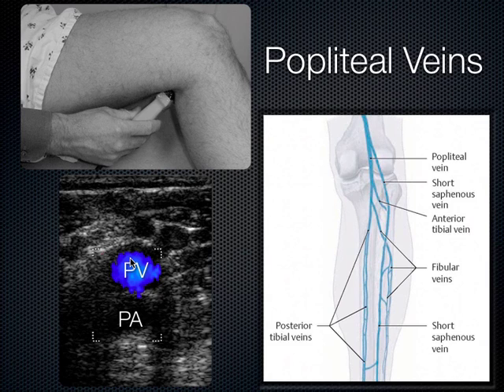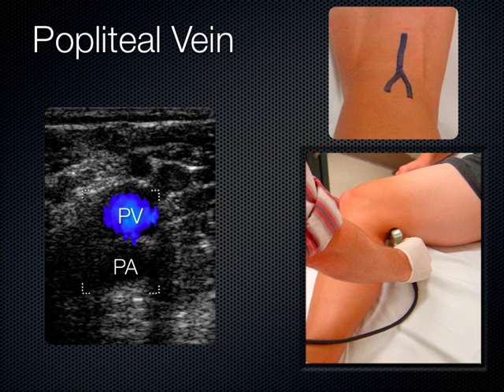And then where does it go after that? It goes from the femoral system up, where does it go? It goes up the IVC, and then it gets into which part of the heart? Right atrium, goes down to the right ventricle, and then from a DVT it becomes a pulmonary embolism, or PE, and about 200,000 people every year in the United States die from a pulmonary embolism. So that's why these things are clinically important. And this is, I kind of drew the bifurcation here a little bit on the back of his leg.